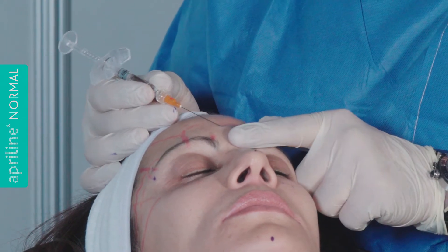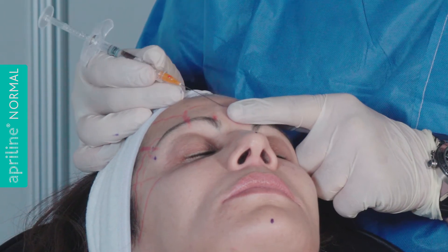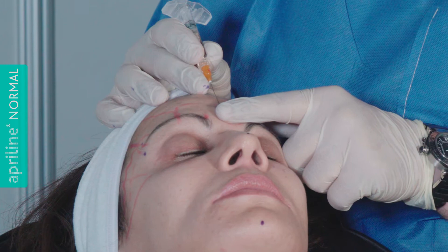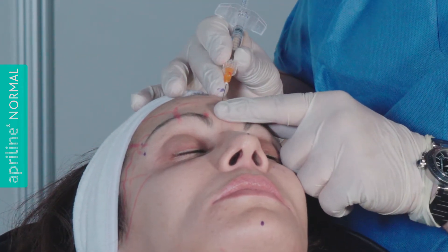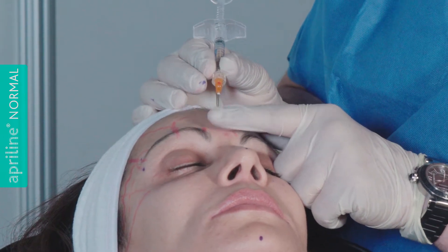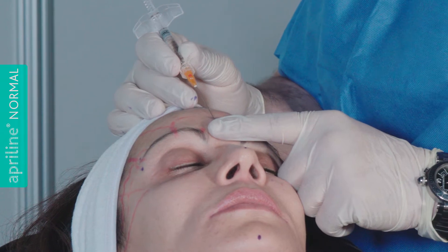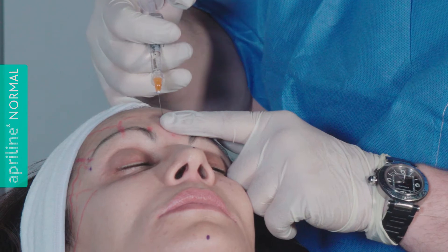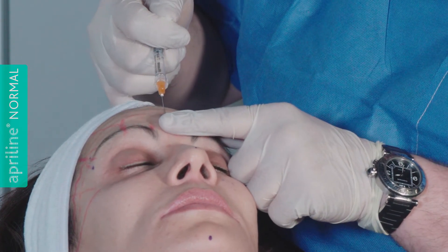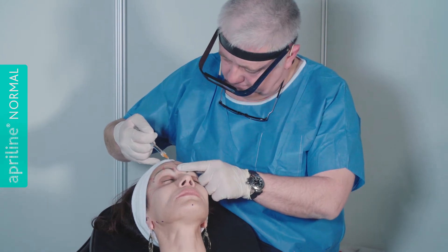Your second hand helps you — remember this is a danger zone so you have to stay superficial. With your finger you can feel the tip of your cannula and then progress. If you have some resistance, don't insist — retire, then push, retire, push — and find the good plane. You create first the little area where you want to inject, but you do it very gently, very slowly. Your finger will feel the cannula because if you go too hard you can cross the skin or go deeper and cross some vessels, causing bruising. So now I can inject here, just to correct the depression and obtain a good convexity between the two heads of the eyebrows and the glabella area.